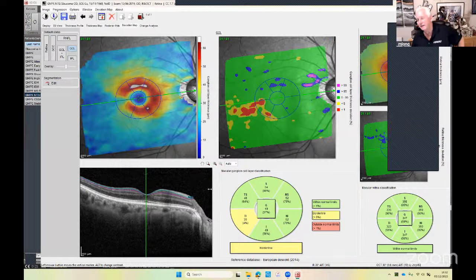Yeah, I think they're very difficult, Manish, to be honest with you. I don't think anybody has a golden answer to that. I've listened to many presentations on what to do. Some say look at the vertical asymmetry in the nerve fiber from the superior to the inferior as one idea to see whether there is any difference. But I don't think there's any golden answer to this.